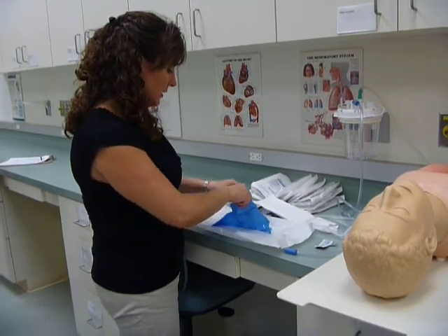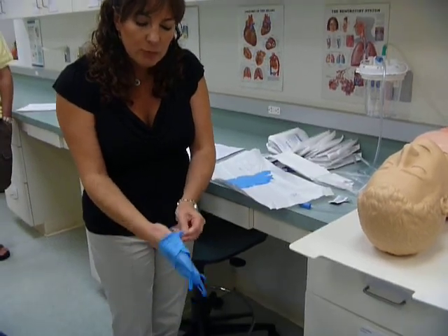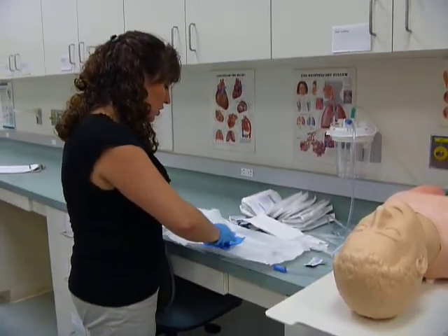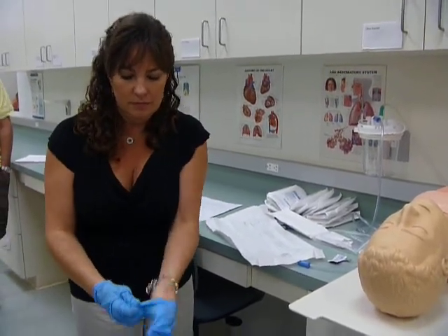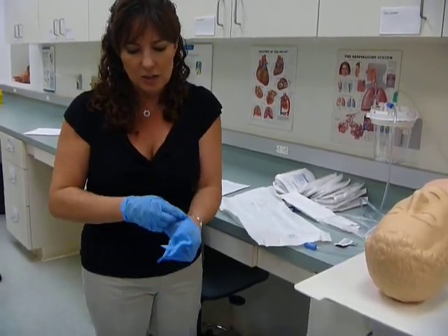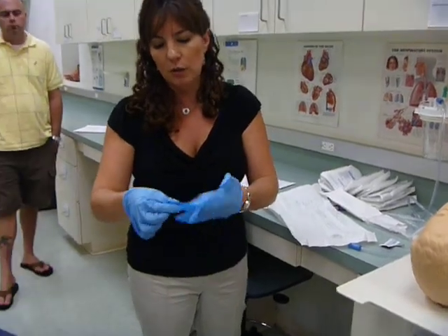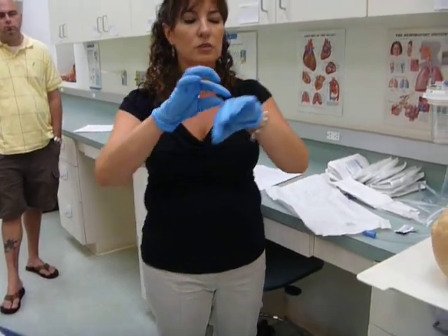Now, once I have that, I can put my gloves on. And again, I'm only touching the inside of my glove. I can't touch the outside because the outside is going to remain sterile. Okay, once I have this glove on, I can touch the cuff on this glove. Where's my thumb? These are kind of sticky. Like in my case, see how my gloves are stuck together? My fingers are stuck together. I can pull them apart because I have a sterile glove on. All right, so both my gloves are on.